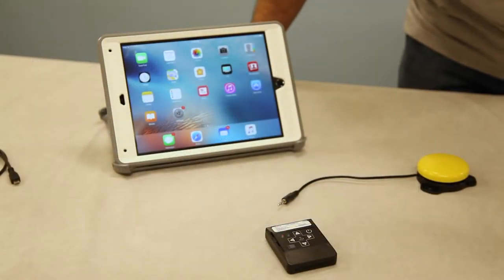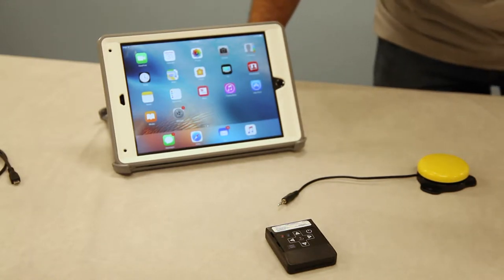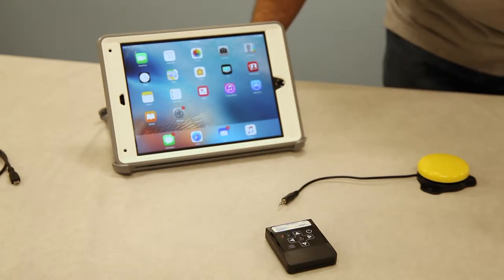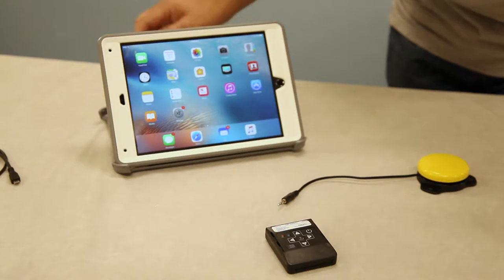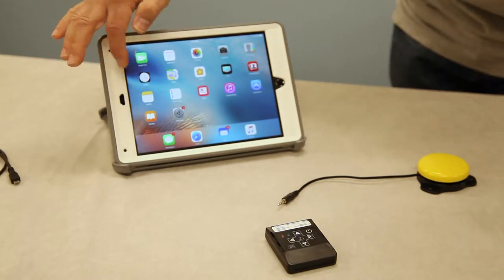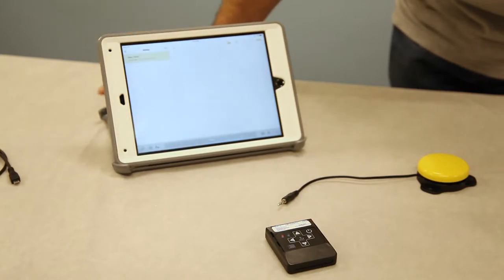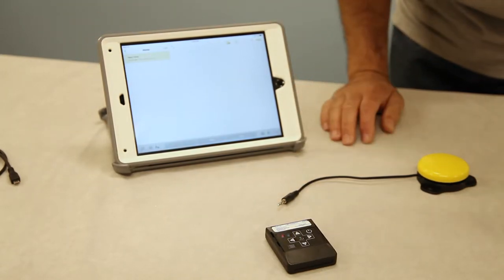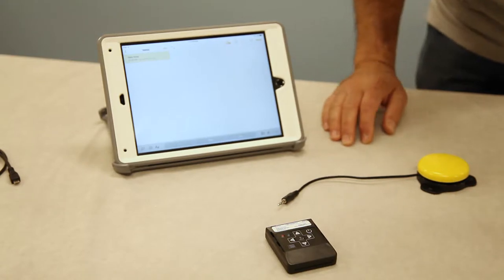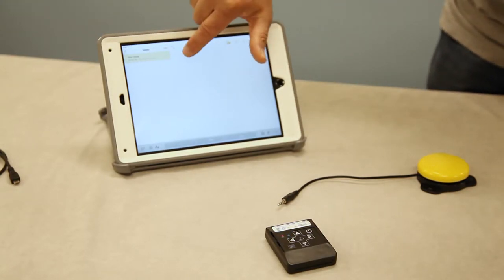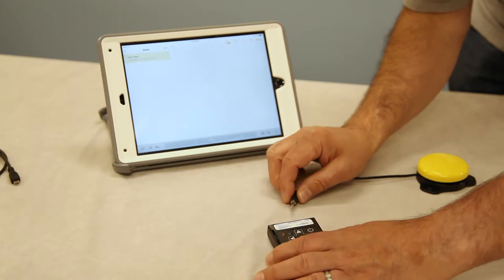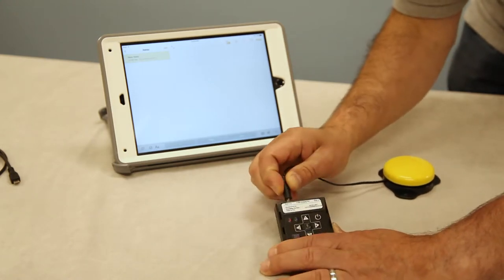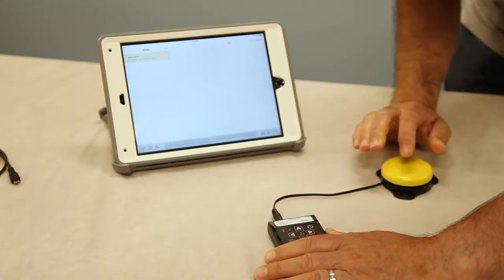So you want to double check what mode you're in. The default mode is mode 5 which is the assistive technology mode. But the easiest way to check that is right here in the iPad's built-in Notes app. So in mode 5, what the interface is going to send to the iPad is the space enter keys. So what you want to do is tap on a new note, make sure your cursor is flashing. So if you plug a switch into port 1-2 here, that's going to replicate hitting the space bar, which it's doing.